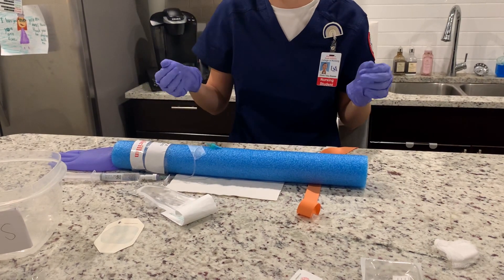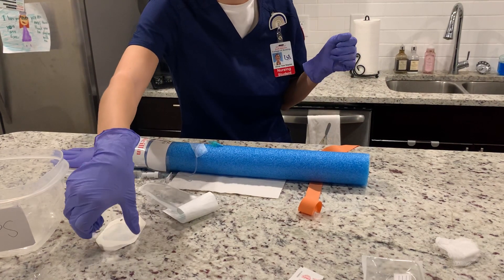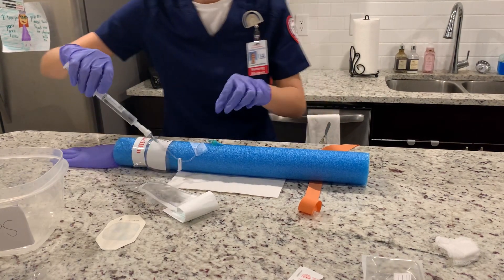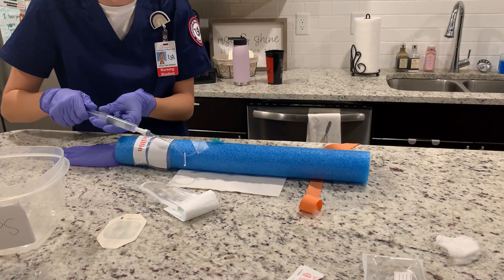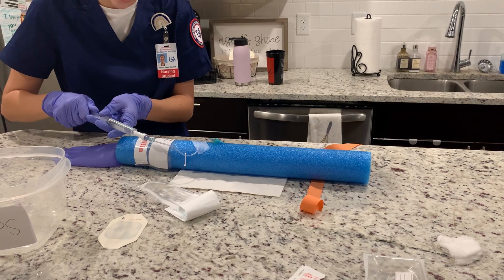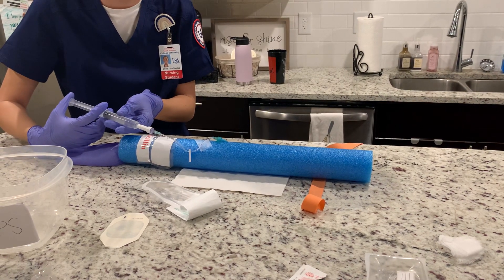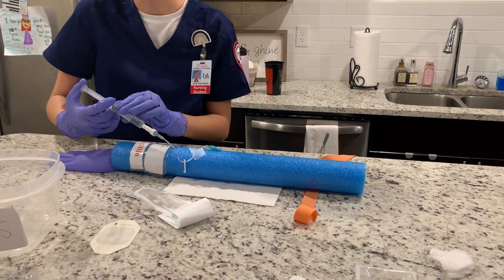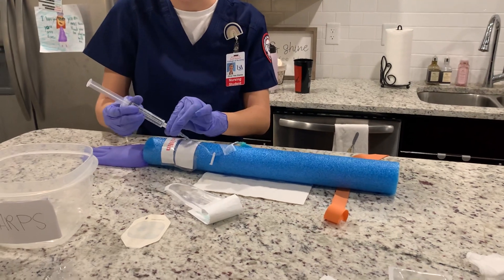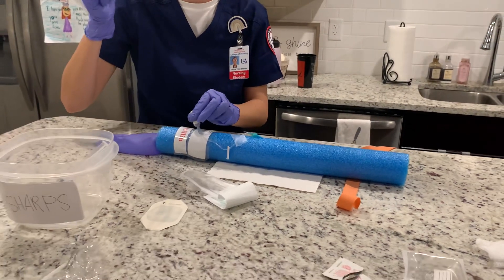After that, I am going to aspirate for blood return. Then I would normally advance all of the saline into the IV, and while doing that I would be observing for swelling. I'm not going to be doing that today, so I'm just going to remove it and discard it into the sharps container.